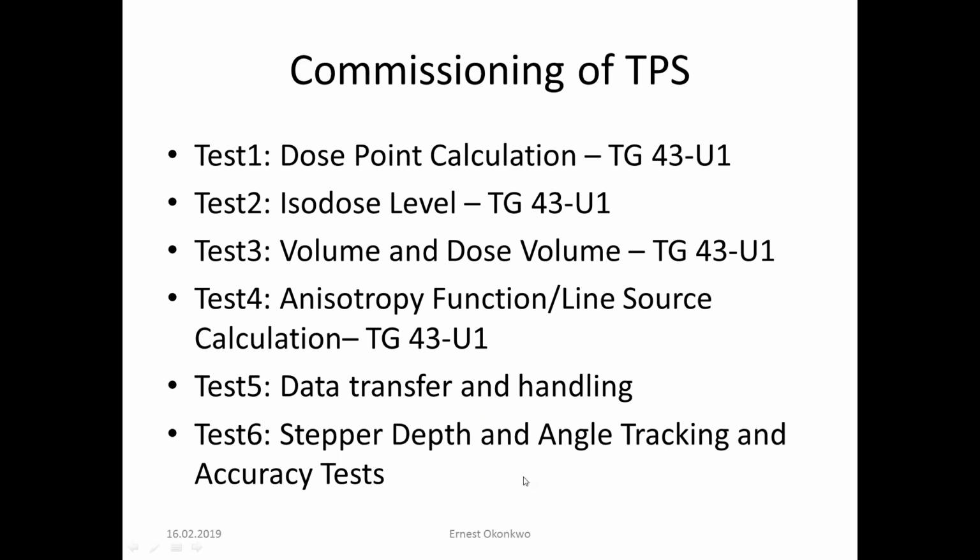Then you have the stepper. Is the depth accurate? The angle tracking, is it accurate? So all these things you have to test. These are things that Professor Hesser already mentioned. So this is the clinical aspect of it.